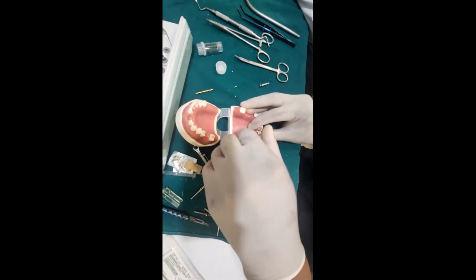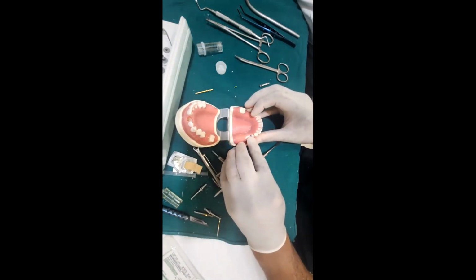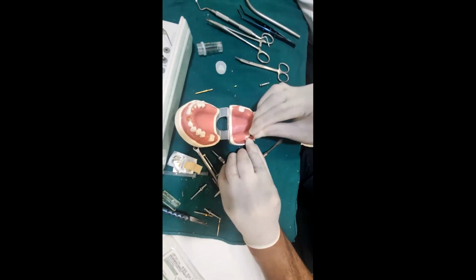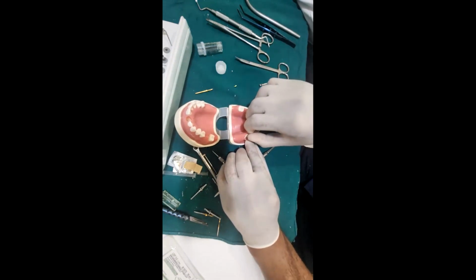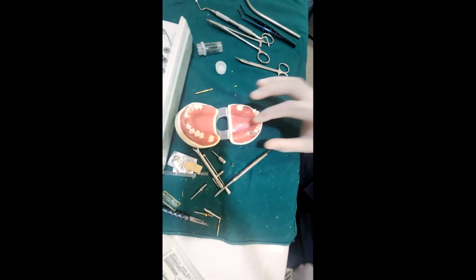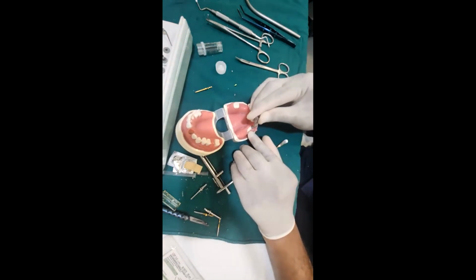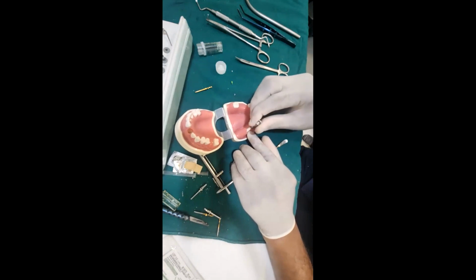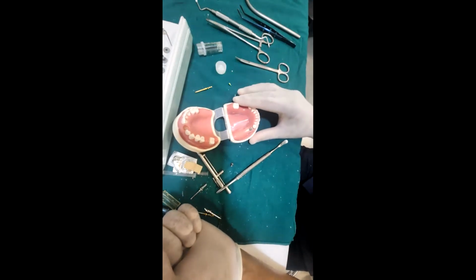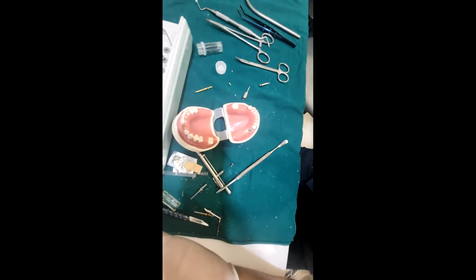So your patient has come after a week of your healing abutment placement. We assume that the mucosa has healed well. So what we will go with is a closed tray impression technique with the closed impression abutment coping. We will snap it and put the impression coping over here. Use the screwdriver to ensure that it is tight in the patient's mouth. After doing this, ensure that you take a radiograph to see the coping and fixture connection. There should not be any gap over there.